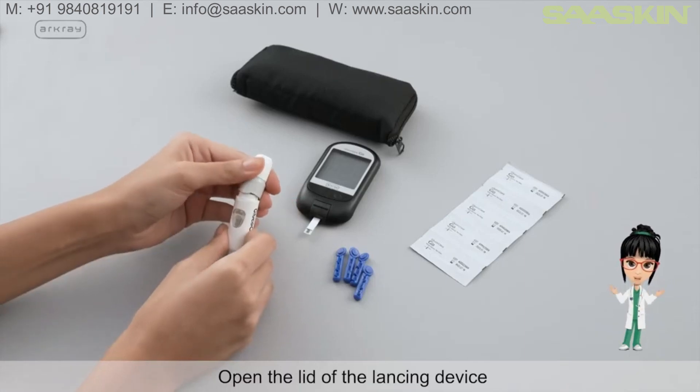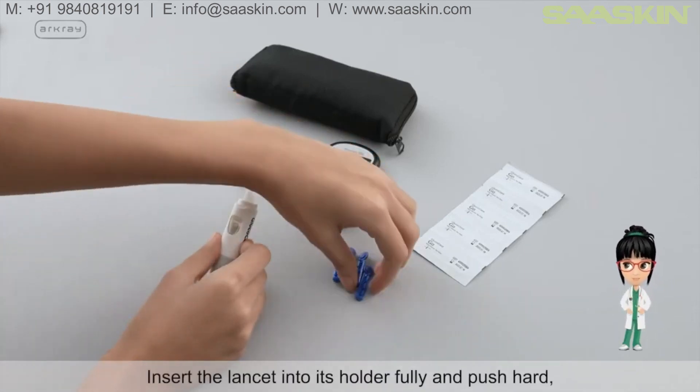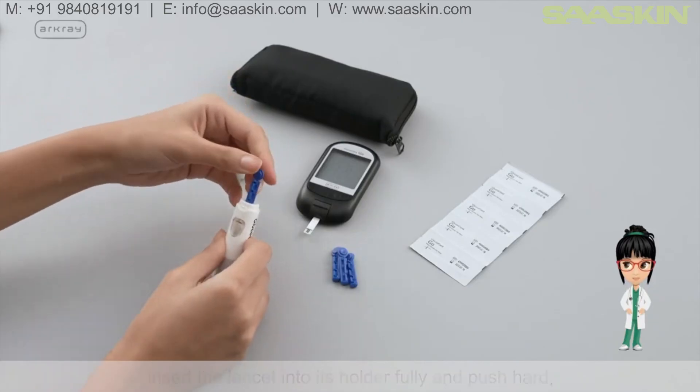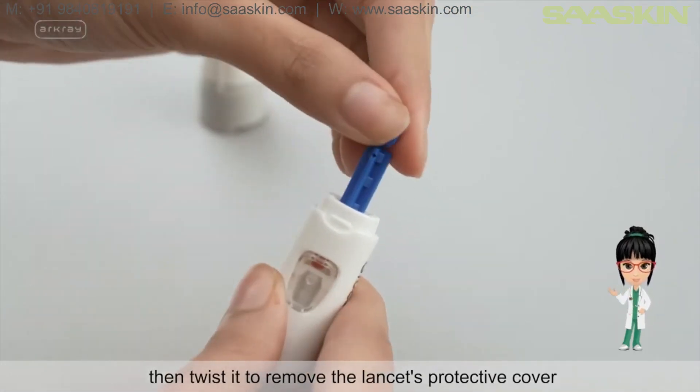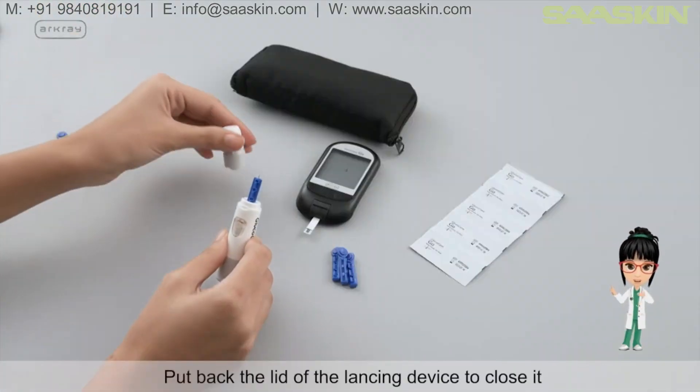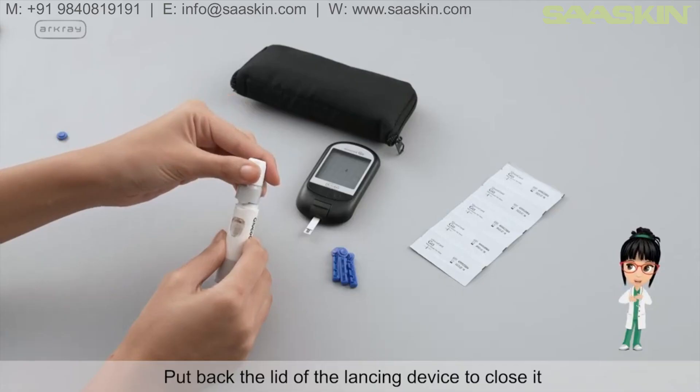Open the lid of the lancing device, insert the lancet into its holder fully and push hard. Then twist it to remove the lancet's protective cover. Put back the lid of the lancing device to close it.